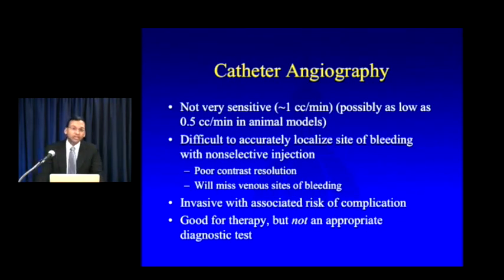What about catheter angiography? Now, there's little doubt that this is a great study for treatment. At least as good as colonoscopy, maybe better. But I think there's, again, very little doubt that this is not a good first diagnostic modality. Of course, you're dealing with an invasive modality that has its own associated risk of complications, including bleeding. It is not that sensitive, can detect bleeds only that are relatively brisk, perhaps about 1 cc per minute.